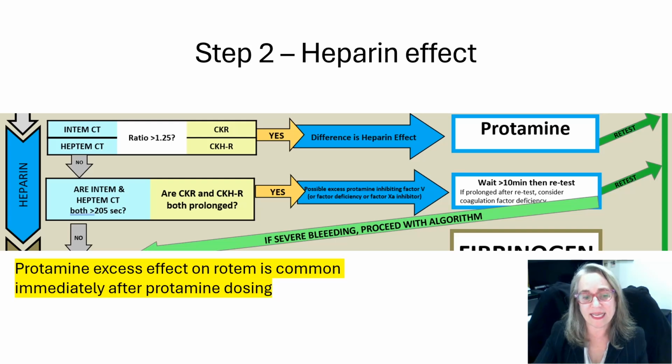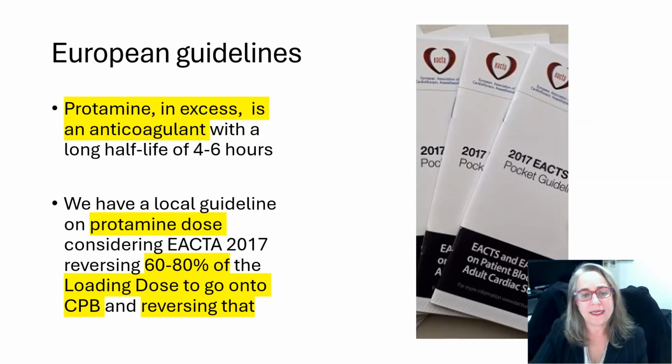The difference between with and without heparinase, more than 1 1/4. The effect of the protamine if it's in excess because it's taken too early. And this protamine excess effect is common because we're not really that patient. We commonly can't wait 10 minutes after protamine to do our test. We might see a little bit of this effect.